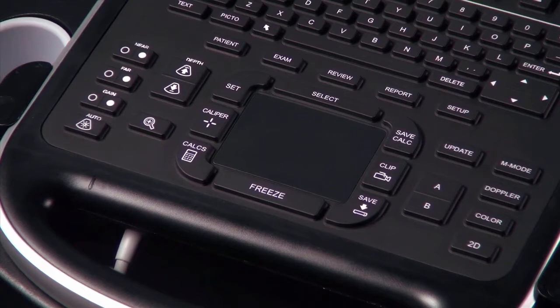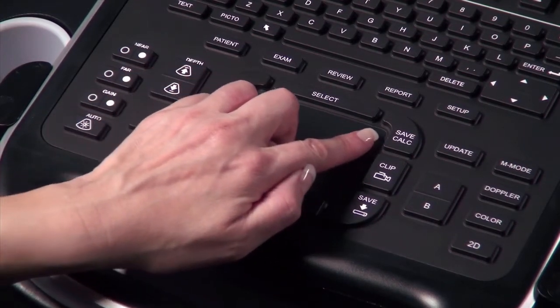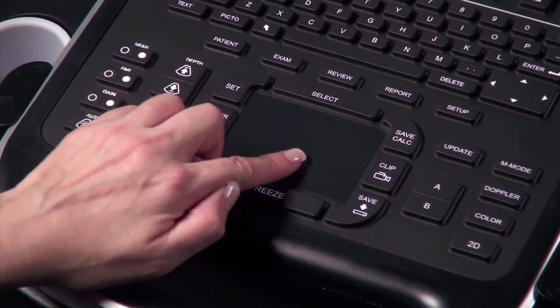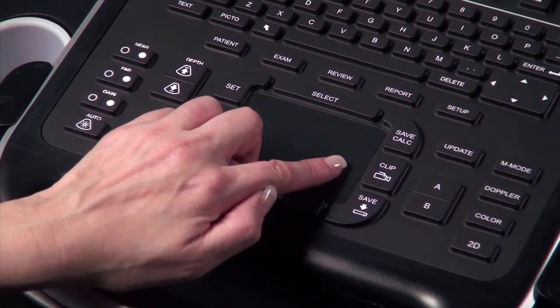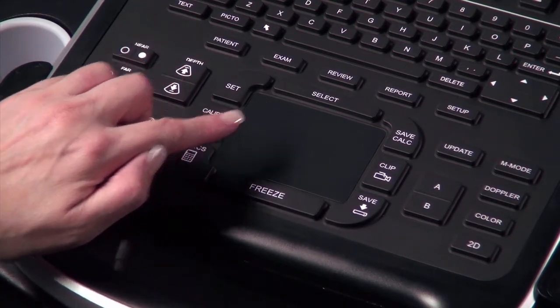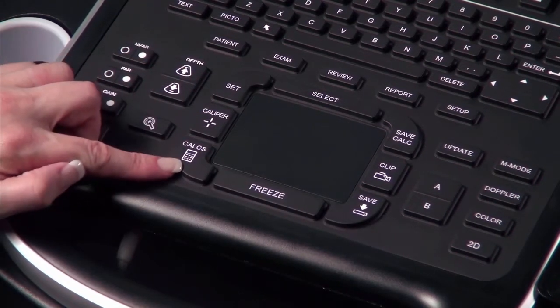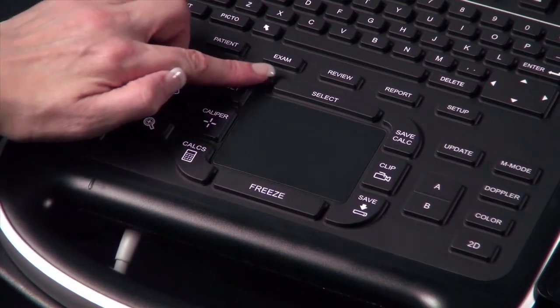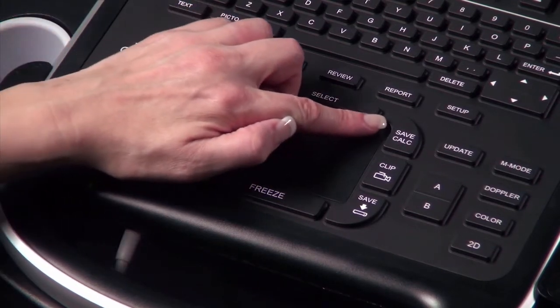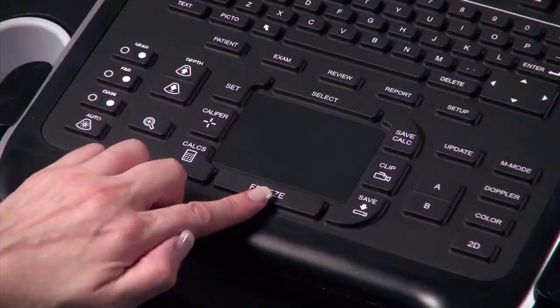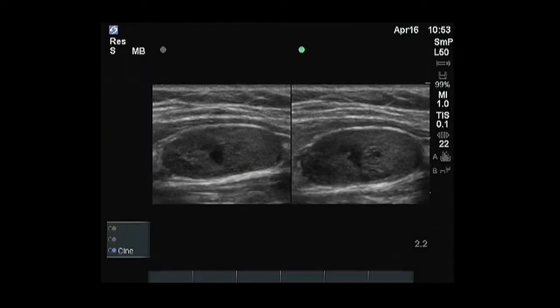In the lower middle of the control panel is the touchpad, which can be used to select, adjust, and move objects on the screen. Surrounding the touchpad are the system controls that are used most frequently. The freeze button stops the live imaging and displays a frozen image.